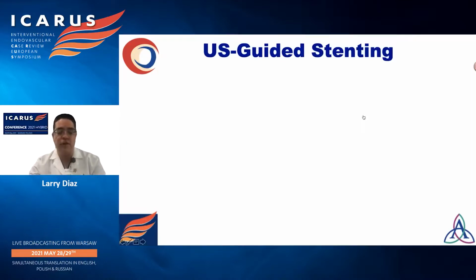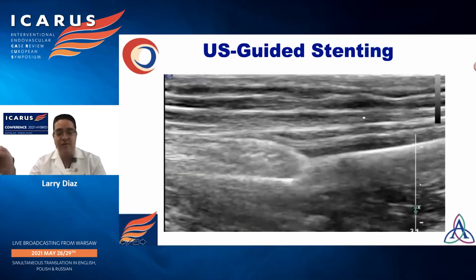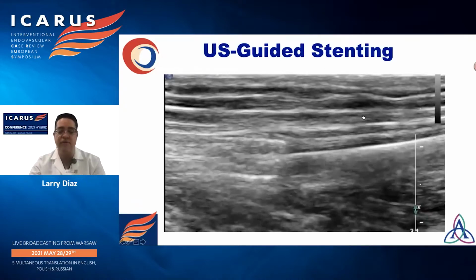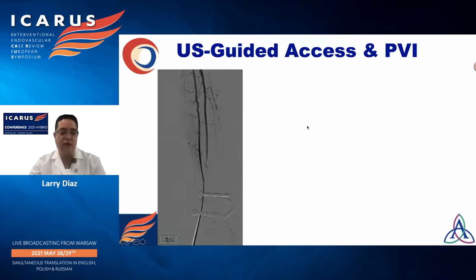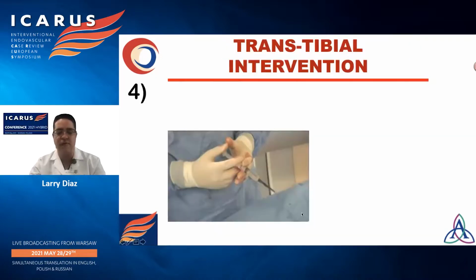And then to stent, I utilize a slender sheath 5/6, which I only put the tip in the foot to pass the shaft into the vessel. And then I remove the sheath as I'm performing this deployment of the stent. And this was our final result with excellent flow. I performed angioplasty throughout the AT. And this was our final picture. And we performed ultrasound evaluation of the site of access to make sure we didn't have an occlusion. As you can see, we have nice biphasic flow.